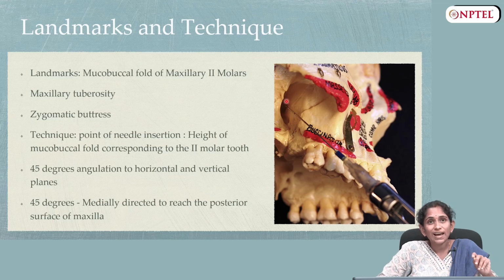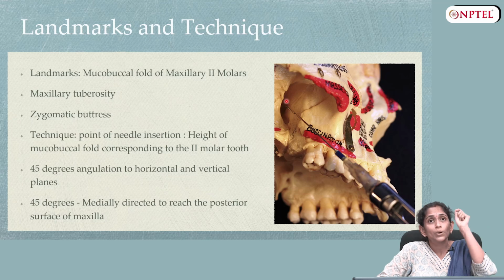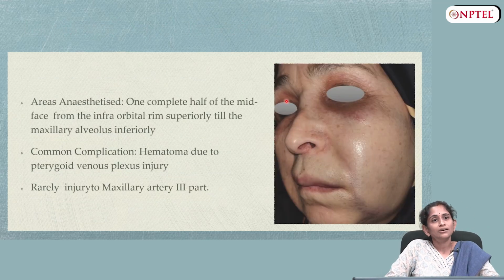Do we have a bony landmark? No, there is no bony landmark. We do not hit any bone in this area. The needle is in the soft tissue. You aspirate in two planes and then deposit the local anesthetic agent.